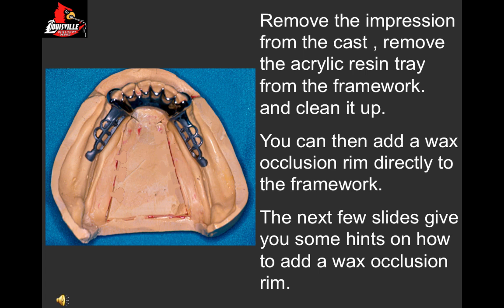Then you can add an occlusion rim directly to this framework. The next few slides give you a hint on how to add this occlusion rim.